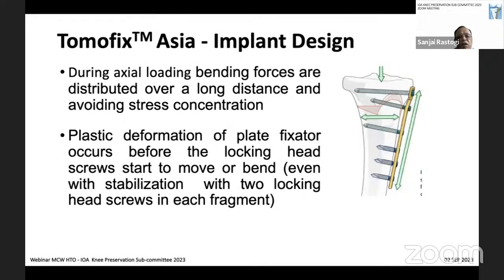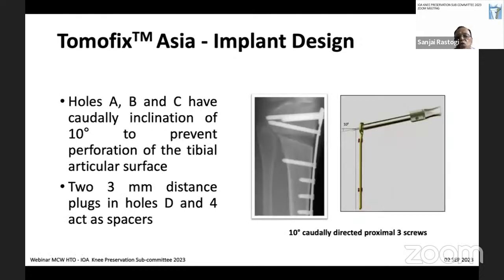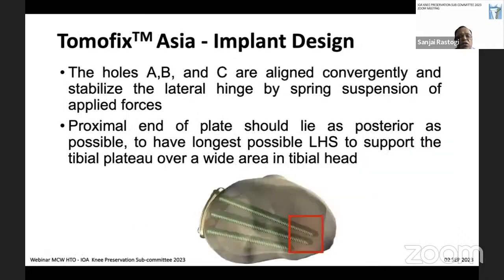Now, with load bearing, there is distribution of forces in a larger area, and this plastic deformation of the plate takes place immediately, which allows micro motion. The holes A, B, C are inclined 10 degrees distally, and hole D and hole 4 take spacers, which are 3 mm, and these help us to preserve the blood supply.